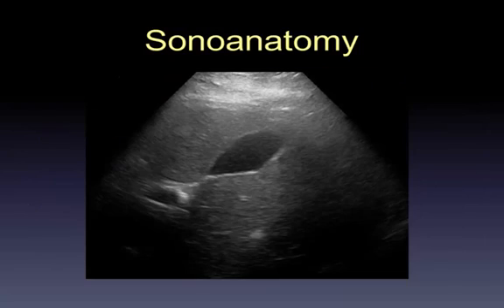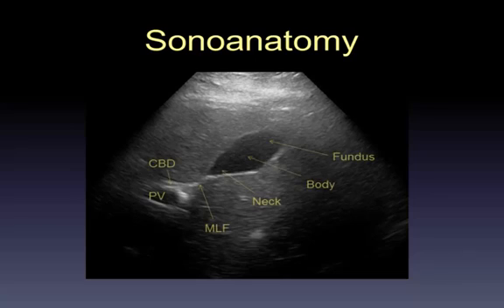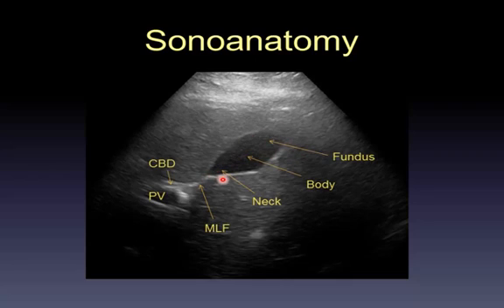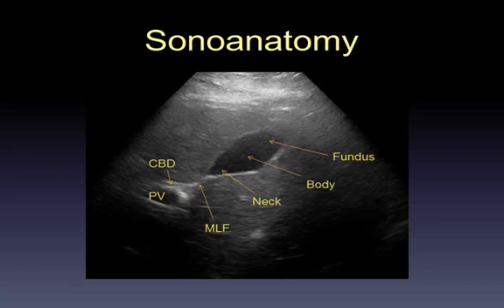A couple of things you need to notice about normal sonographic anatomy: when you examine the gallbladder with ultrasound, examine the whole thing — if you miss part of it, you might miss a focal stone or other pathology. Always make sure you see the entire fundus, body, and neck of the gallbladder. The gallbladder should sit in the middle of the liver, and the main lobar fissure should be nearby, leading you to the portal vein — and if you can find the portal vein, you should be able to find the common bile duct.